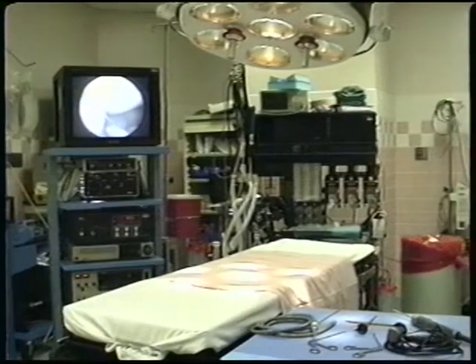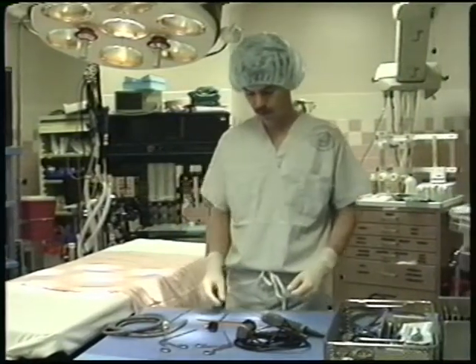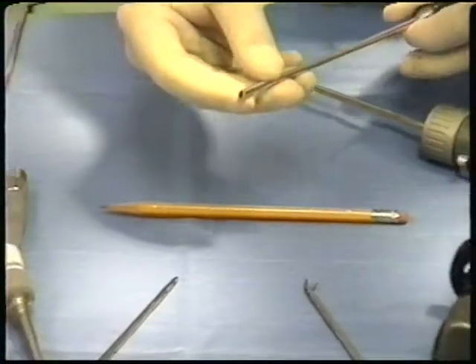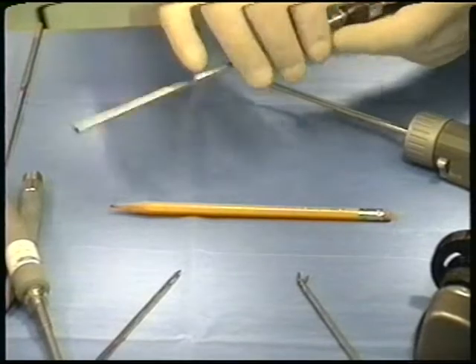Here we are in a typical operating room where you will be having your surgery. We'd like to show you the instruments. The arthroscope is approximately 4 millimeters wide, and the lens at the tip is angled 30 to 70 degrees to visualize all parts of your joint.